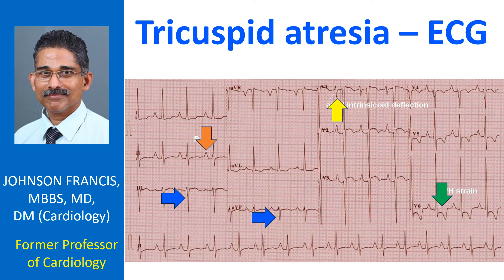All these features together in a cyanotic congenital disease are characteristic of tricuspid atresia.